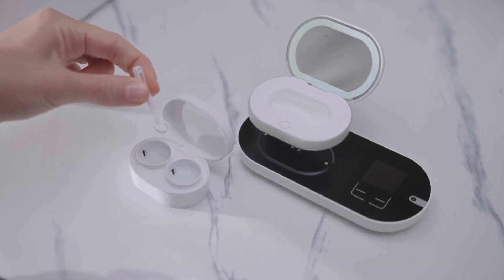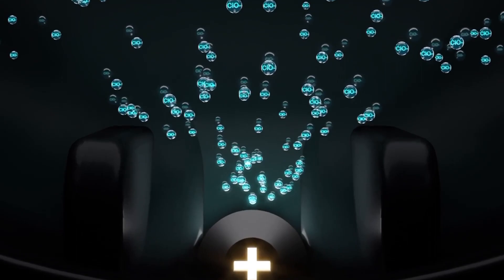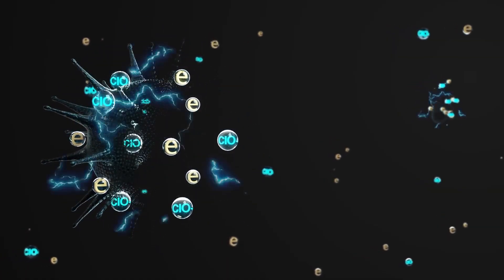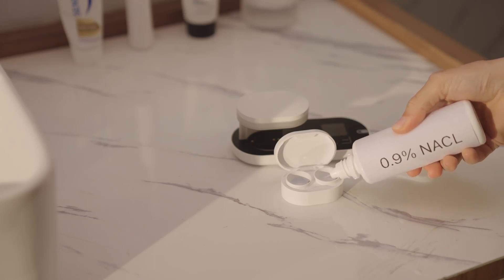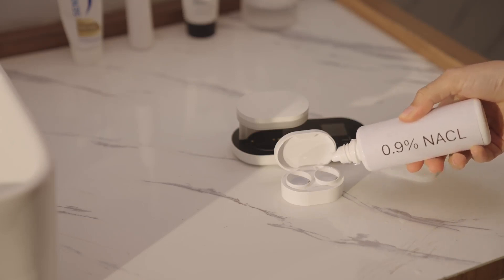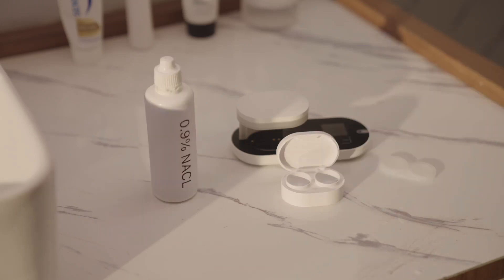In the meantime, ReO2 will produce hypochlorous acid, the safest and most effective agent to kill bacteria and viruses. All of this is achieved with a simple 0.9% saline solution without any bacteria, preservatives, or surfactants, which are common ingredients of regular contact lens solutions.